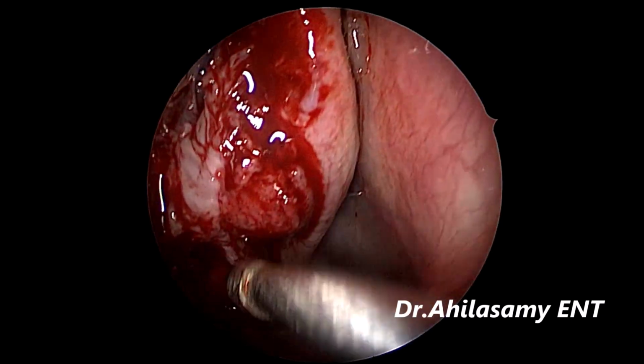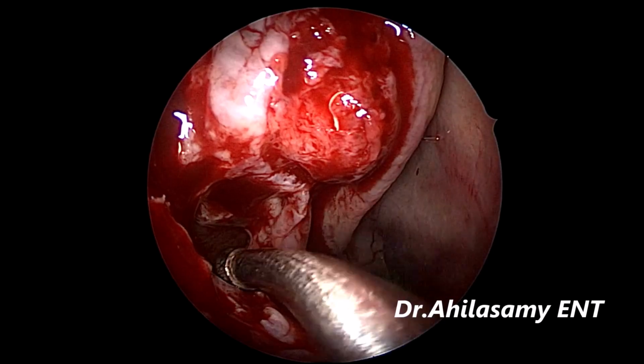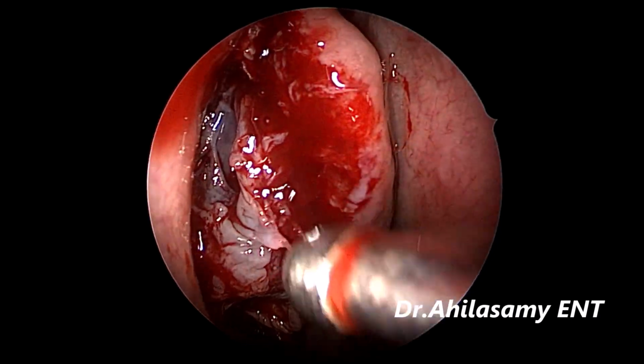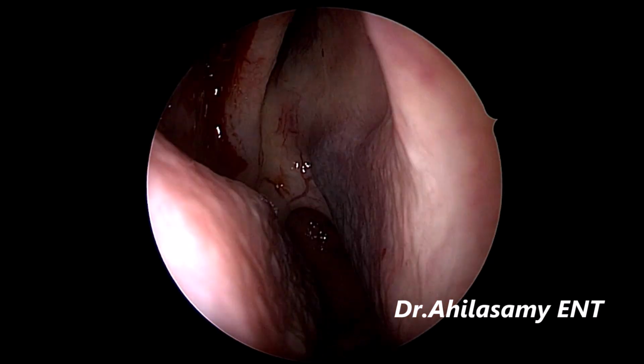That's a bulla. That's a maxillary sinus. Edematous mucosa, pus collection, everything. This patient had a chronic cough, nasal block, hyposmia, everything for around 1 year.